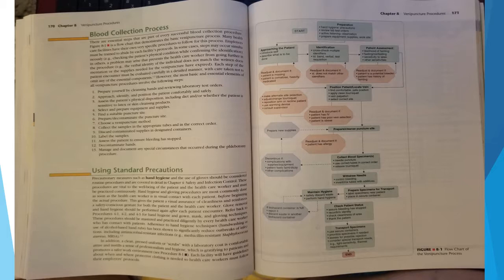Number 5, find a suitable venipuncture site. Number 6, prepare or decontaminate the puncture site. Number 7, choose a venipuncture method. Number 8, collect the samples in the appropriate tubes and the correct order. Number 9, discard contaminated supplies in designated containers. Number 10, label the samples. Number 11, assess the patient to ensure bleeding has stopped. Number 12, decontaminate hands. Number 13, manage and document any special circumstances that occur during the phlebotomy procedure.